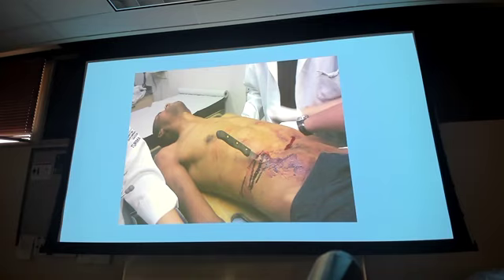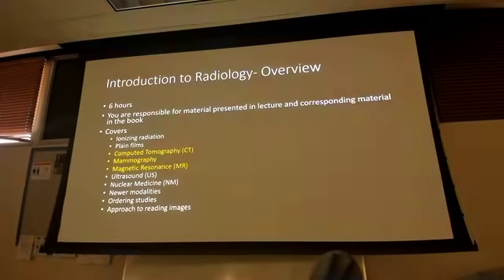But so sure, we're doing what we need to do. But right, what good is an x-ray going to do for me here? Probably not a whole lot. I know where the knife is at, but what I don't know is what did it affect on the inside, right? And the x-rays we looked at are very generalized, very basic. It doesn't really map out a lot of the organs really well. It doesn't show the detail that I need. And so this guy would end up getting a CT scan, and that's kind of what we're going to talk about today.